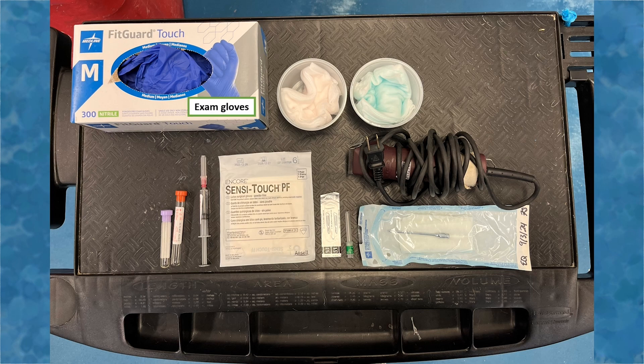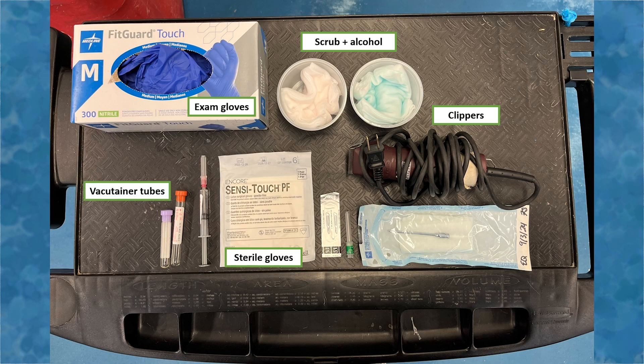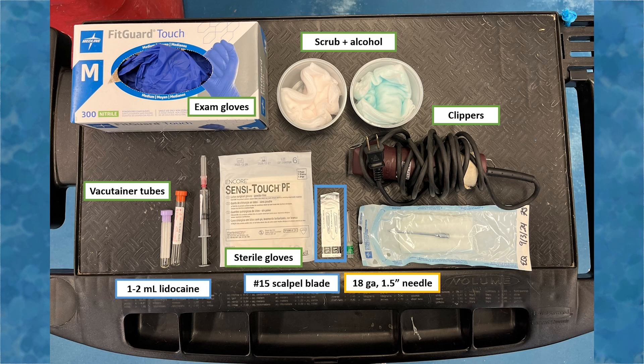Materials needed for abdominocentesis include exam gloves, scrub and alcohol, clippers, sterile gloves, and vacutainer tubes for sample collection including a red top and a purple top tube. The procedure can be performed one of two ways: either using an 18 gauge inch and a half needle, or alternatively a T cannula, in which case one to two milliliters of lidocaine, a 15 blade, a T cannula, and sterile gauze will also be needed.